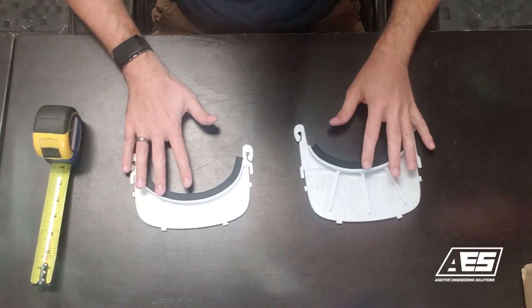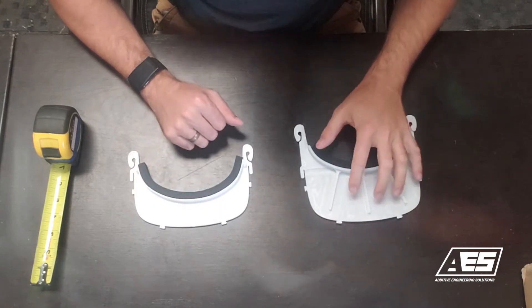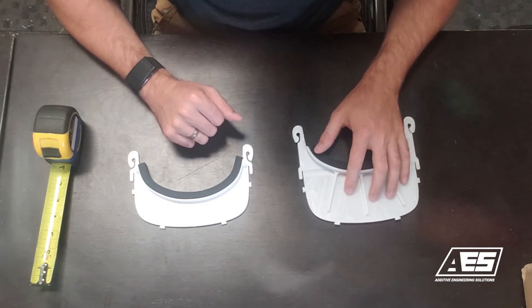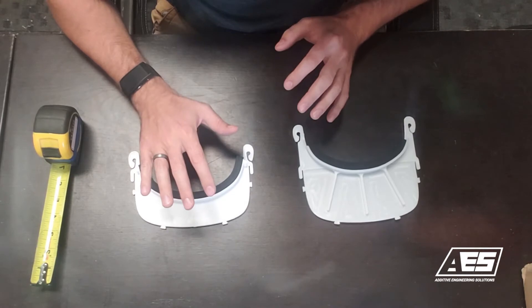We offer two different face shields at AES. The one on the left is the standard face shield, and the one on the right is the one that we specifically designed to work for dental professionals while using their loops and light. The standard one will work with loops, just not enough room for the lights.